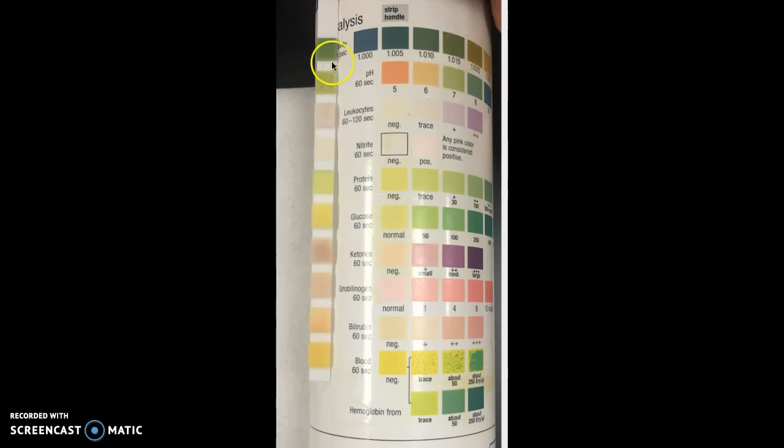Every strip is different depending on the container it comes from, so you have to make sure you have the right strip to match up with the key on the container.